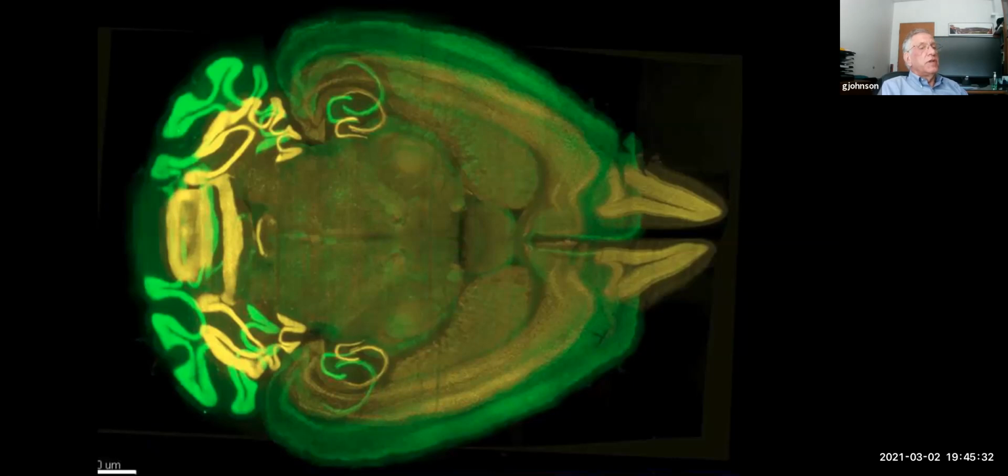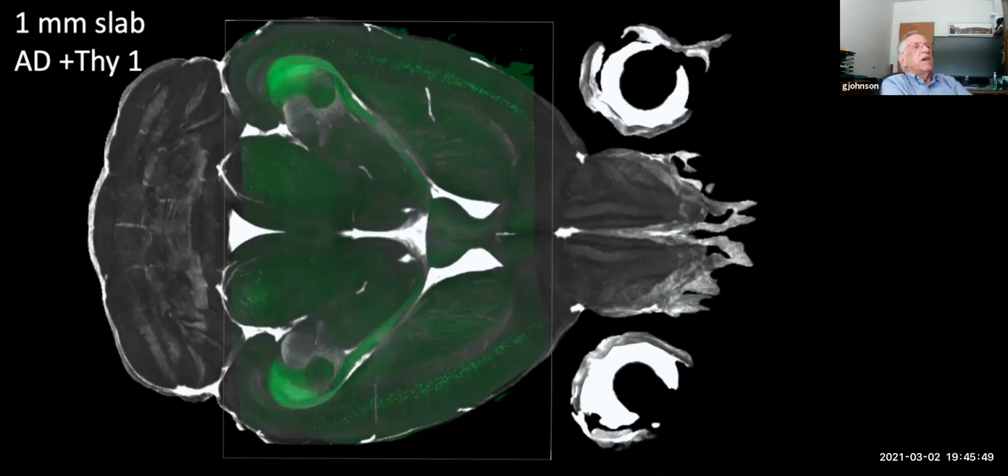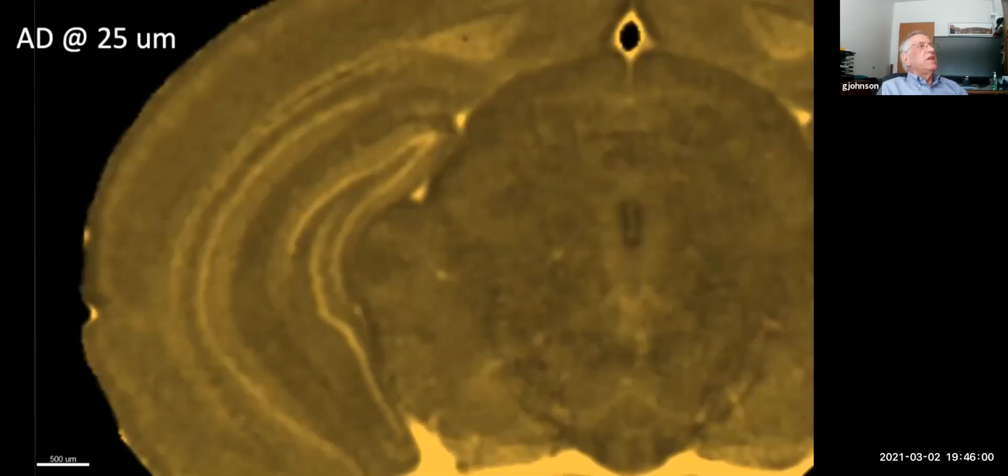So you see that the distortion is as high as 40%. It turns out it's not really isotropic. It becomes distorted differentially along the z-axis. So we've generated yet another pipeline that let us register these two data sets together. And you can see them superimposed here, in a macro sense. And then finally, you see the axial diffusivity that I've colored in yellow here.